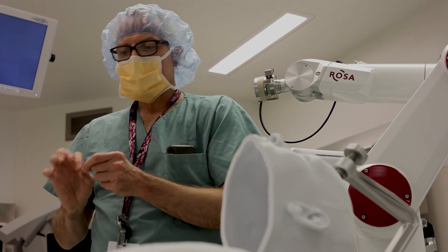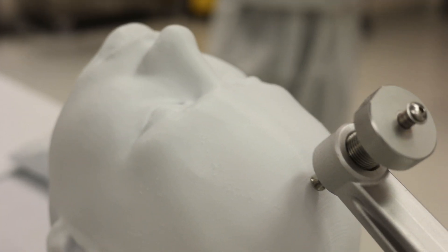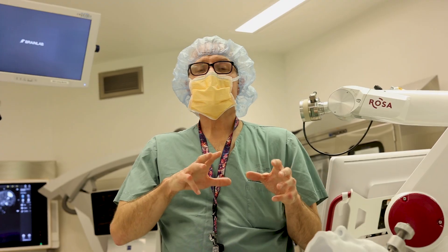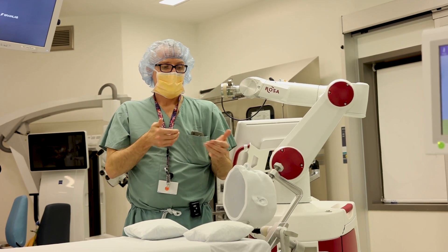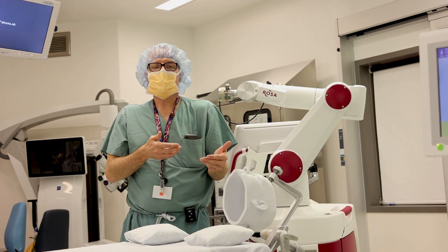We measure a stylet — a relatively rigid but small, less-than-a-millimeter wire — to the distance that Rosa gave us to the target, and then we pass the stylet into the brain. We're measuring anywhere from 10 to 15 points in the brain with a single electrode, and we're putting in anywhere from 10 to 18 electrodes total. The way to think about this is EEG in three dimensions — not just the surface of the brain, but three dimensions through the brain. That's why it's called stereo EEG.